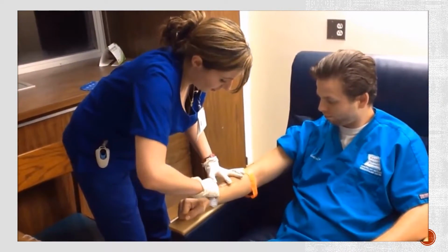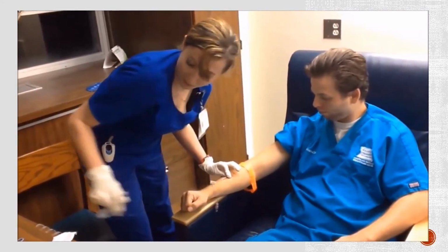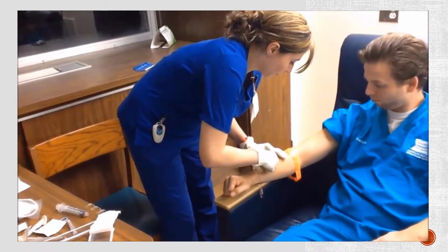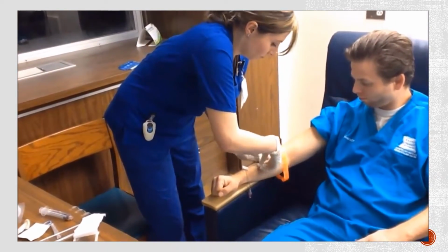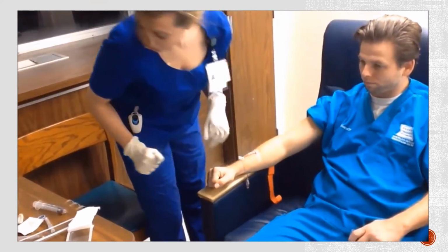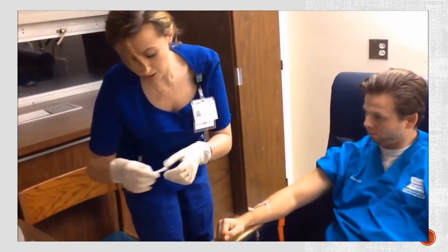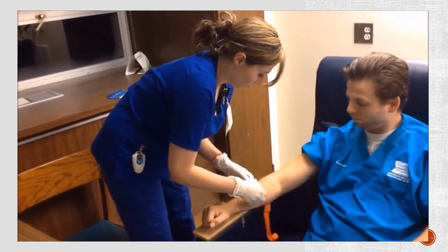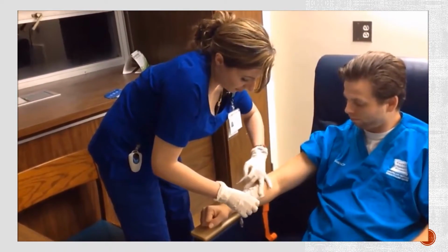Then you will secure it. And you have to be very careful that it doesn't come out of the vein while you're doing this. So I'm just going to secure this one across, but there's different methods for securing it. Okay. Now it's loosely secured, and I'm going to put a tegaderm over it, just to keep it aseptic. I'll place a tegaderm over it.